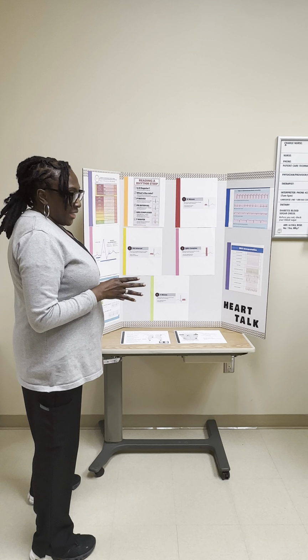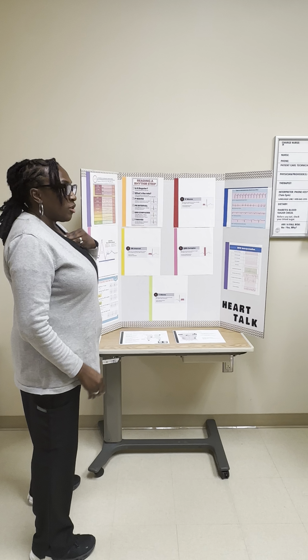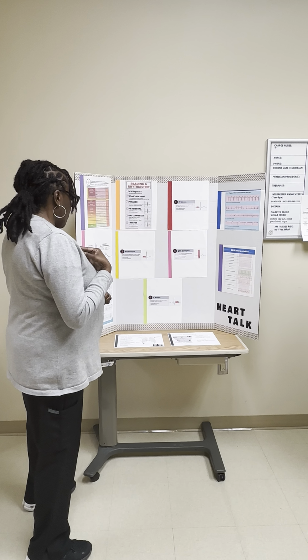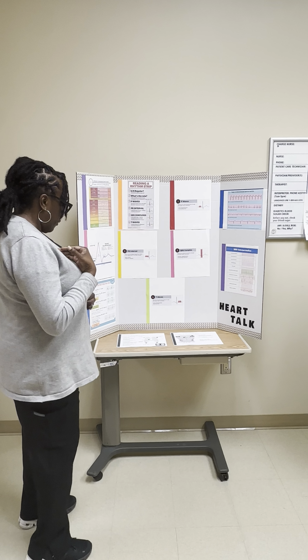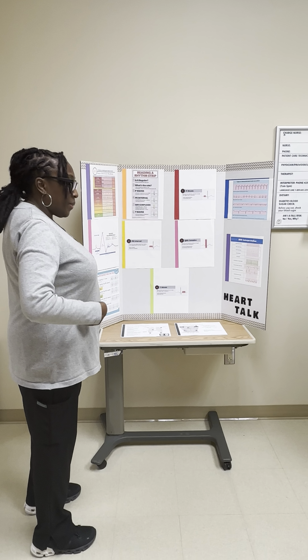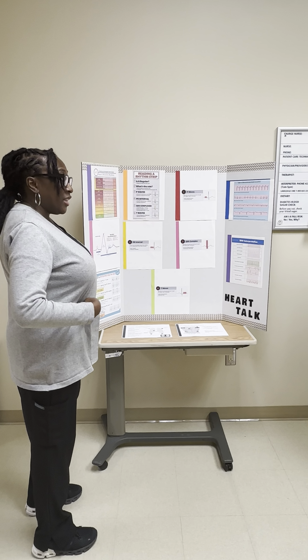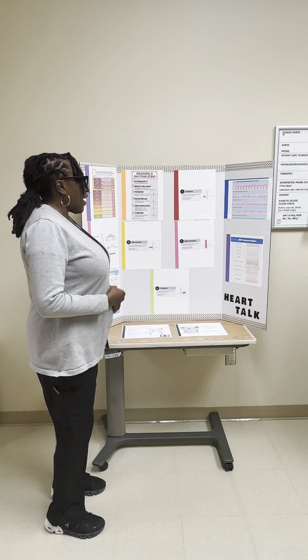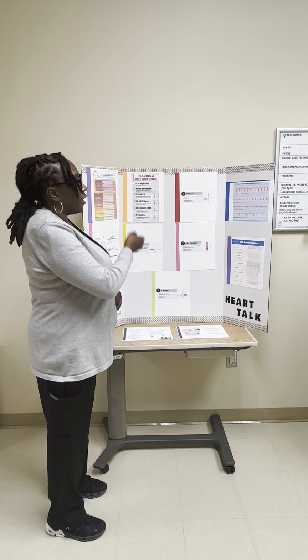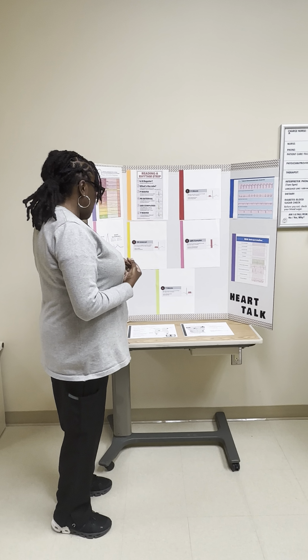We want to make sure when we place our leads, we are placing them on intact skin. Some of the guys, we may have to shave those areas. We don't want excessive hair or burn areas. We're placing left arm, V1, left lower limb, and right limb. When we're placing those lower limbs, those red and green, we want to make sure we're placing them beneath the rib cage. Okay? So we have an acronym: black over red, smoke over fire, white over green, clouds over grass. And then that brown is going in that fourth intercostal space.